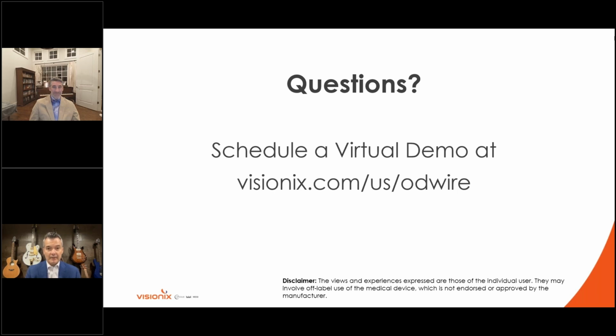Adam, there are several conditions that a new surface over the eye would benefit. Some of those are pellucid or any other ectasias that the patient may be experiencing, irregular corneas after LASIK or RK, any type of EBMD. These individuals oftentimes are floating around in our practices with reduced best corrected visual acuities. These individuals do remarkably well with these lenses.